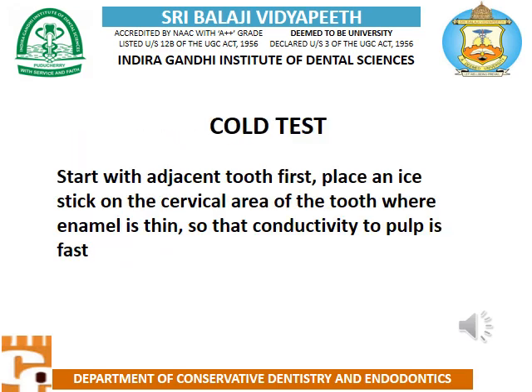Cold test. Start with adjacent tooth first. Place an ice stick on the cervical area of the tooth where enamel is thin so that conductivity to the pulp is fast.